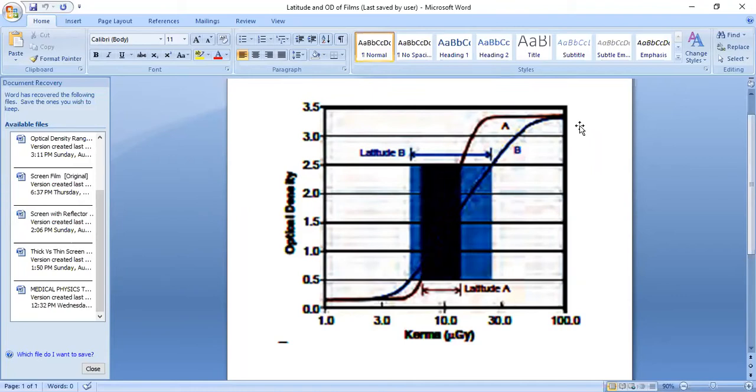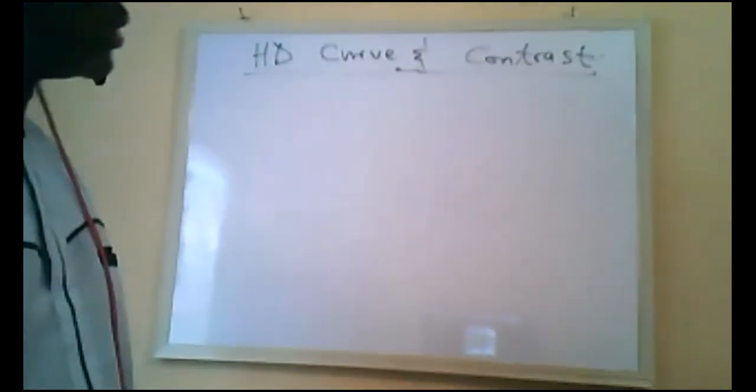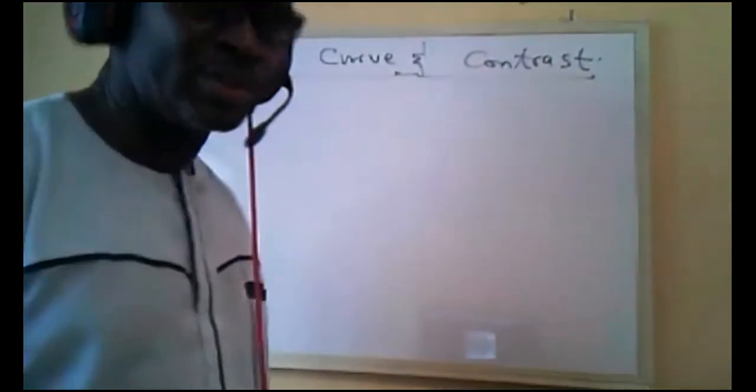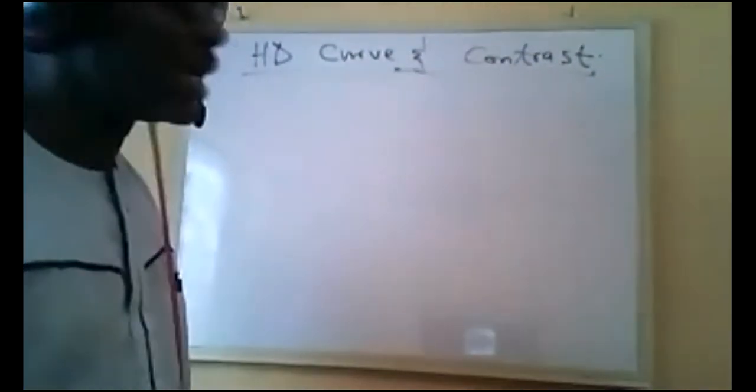So films with a lower latitude have higher retake rates than the ones that have high latitude. I just saw one of the charts. Somebody asked about F. Thank you for the question. I think somebody also answered it. F is actually 4. Trying to rush some things, we can also go back and read up, and how B is the best, and so on.